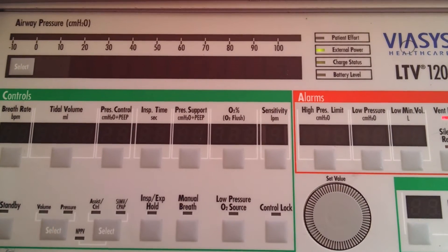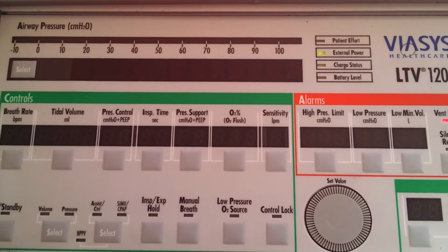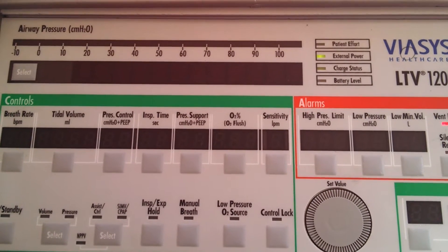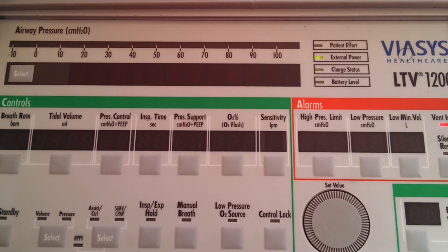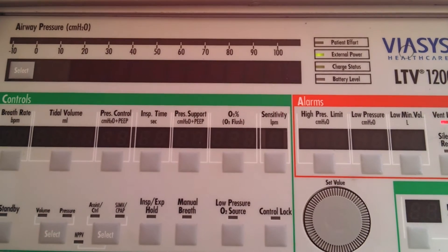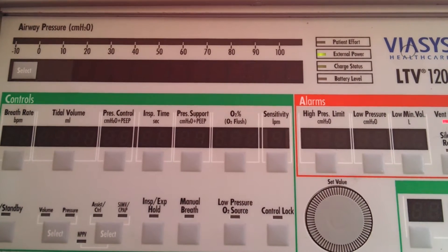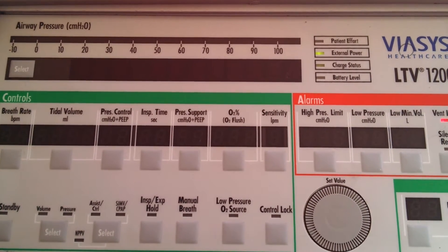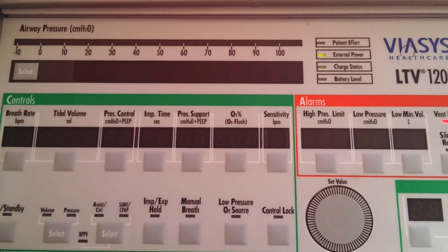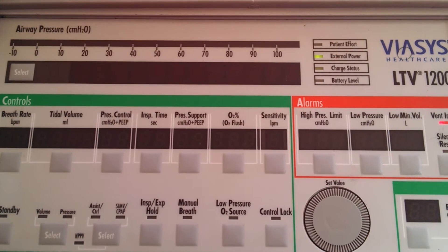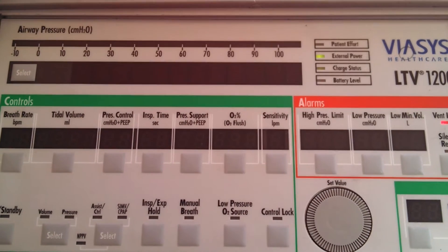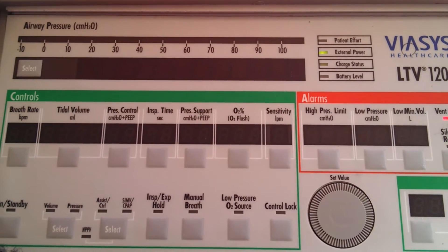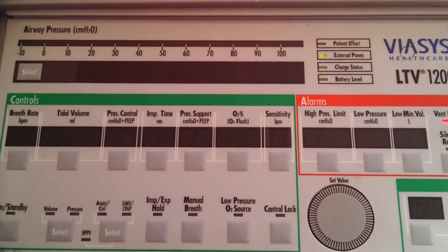We're going to go over the BiPAP non-invasive function of the LTV-1200, as this is an area I know people have some trouble with sometimes. I'm going to show you two different ways to put it into a BiPAP type mode using the LTV-1200.